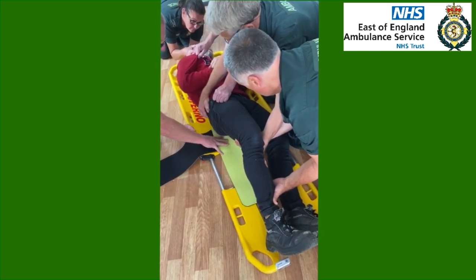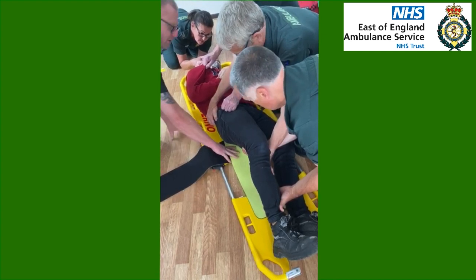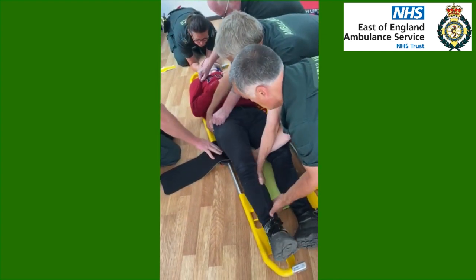Okay, that's enough, stay where you are. Pelvic binder's in place and we're going to go back on your command again please Sarah. Ready, set, roll. That's great, great stuff.